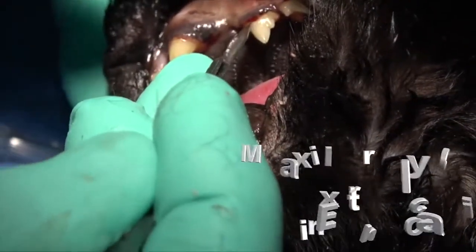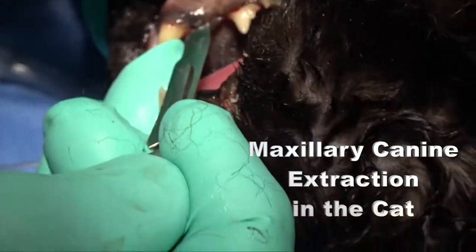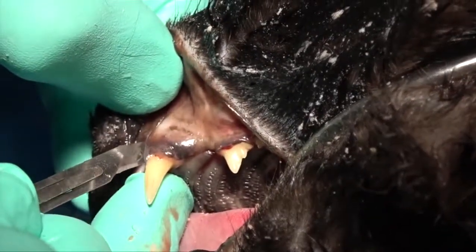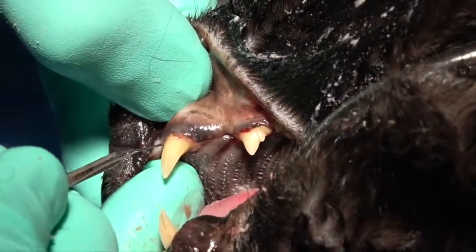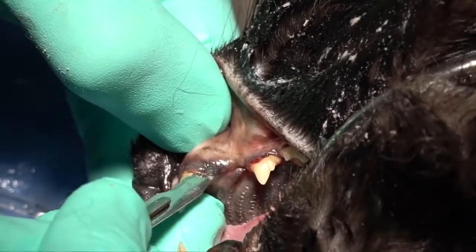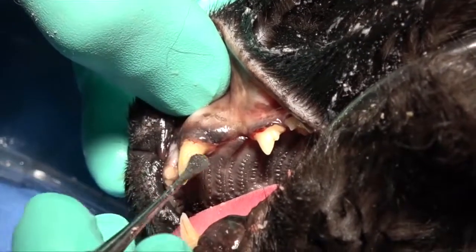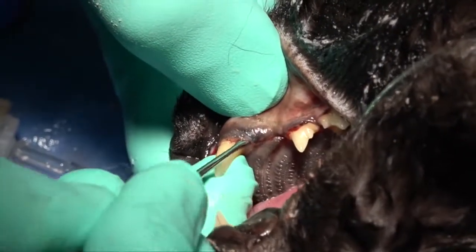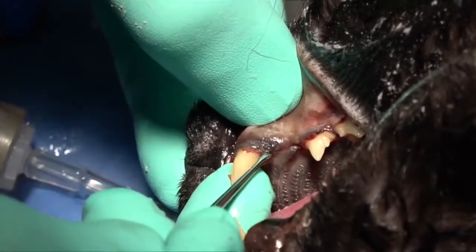The incision for the maxillary canine extraction in the cat starts back at that third premolar, comes rostral, and then we'll do a vertical releasing incision in front of any bone expansion in the diastema between the incisor and the canine tooth. We want to make sure we get mesial to that bone expansion so that it's easy to remove, keeping our burr away from the flap on the mesial aspect of the mucosa.